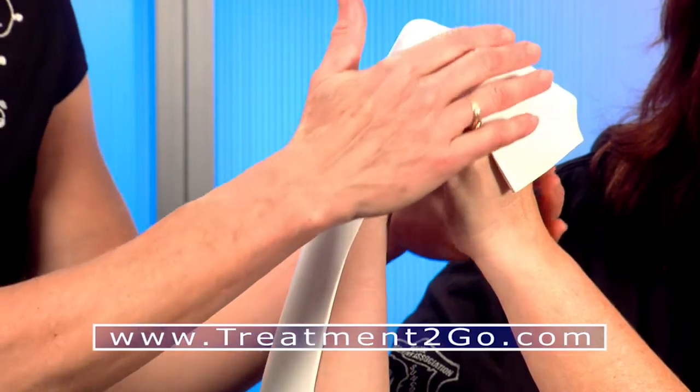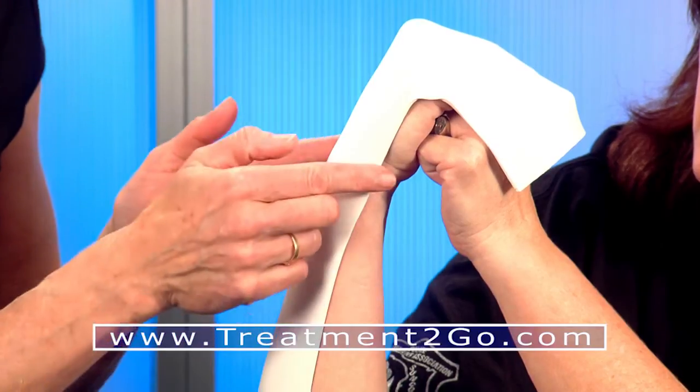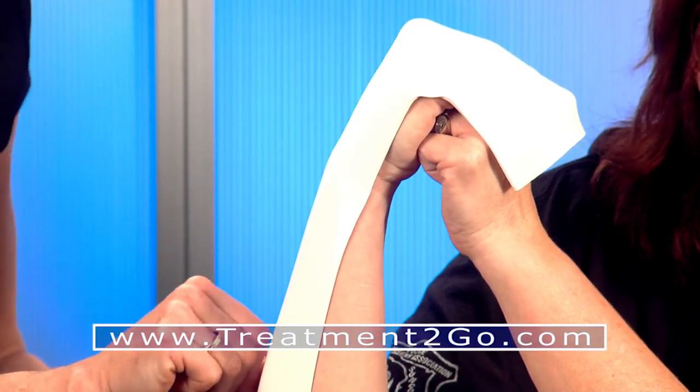We'll just give this a second to harden. Make sure your patient maintains the proper position while the material hardens, and you can even mark with your fingernail all the areas that you would want to trim.